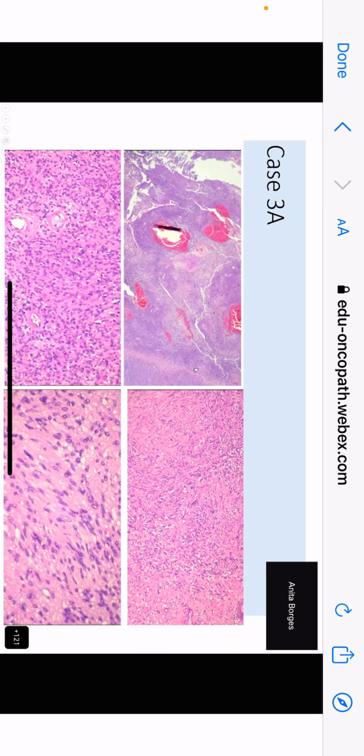I thought it's a vascular transformation of the lymph node, probably a nodal angiomatosis. Nodal angiomatosis. All right. And we have now Suvaita. Suvaita?